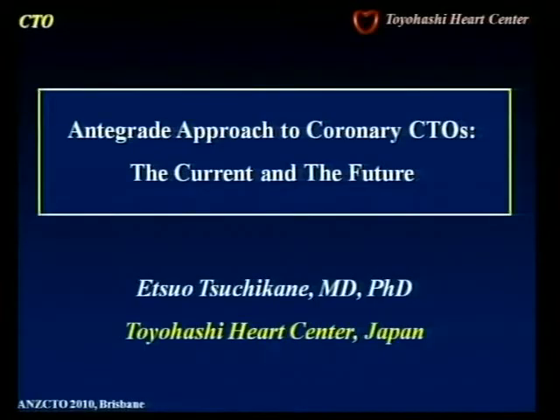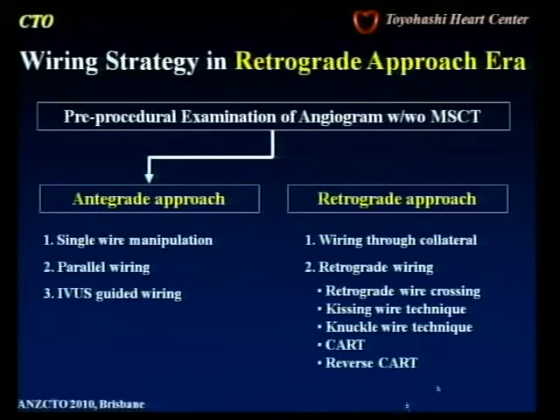Okay, thank you, Scott, and good afternoon, everyone. And thank you for the invitation again to the very nice CTO Club Meeting. So my first topic is the Antegrade approach, and I will talk about the current situation and future direction.